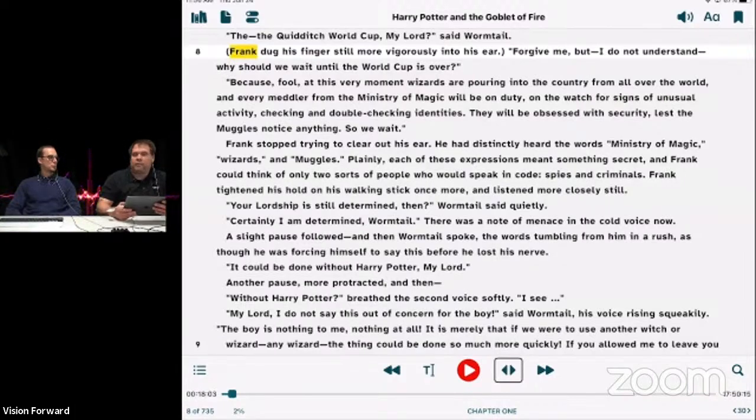Besides moving while it's playing it back, you can also navigate by heading, by highlights, and by bookmarks. So you're able to highlight text here. You're able to set bookmarks in specific spots so that when you want to come back and view those, you can do so. In the bottom left corner is a way we can bring up a list of all that.